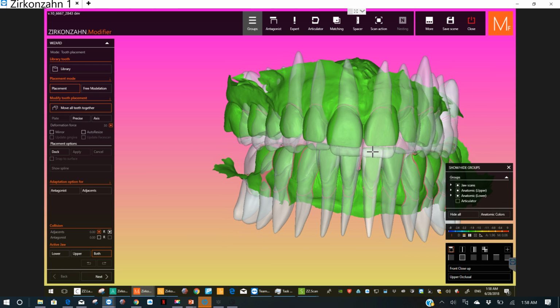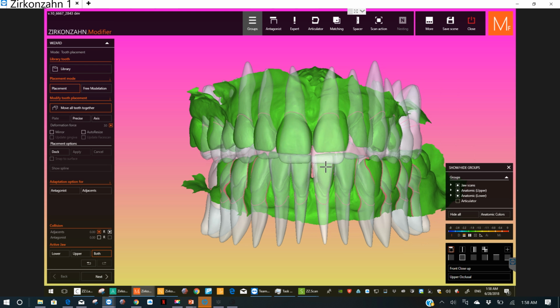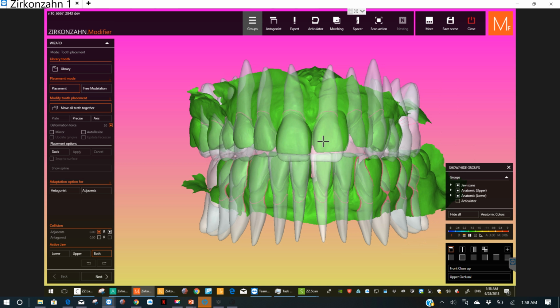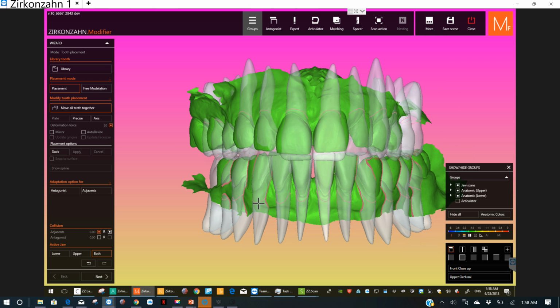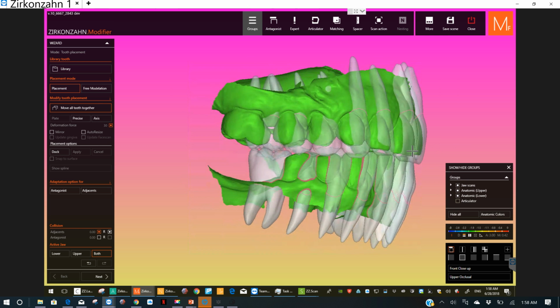If you want to err on a little bit of the long side, it's easy for us to adjust it. It's hard to add. So I kind of automatically just, if you did a good job lining it up, you should trust what you did, and it'll do a pretty darn good job. That might be a little bulky in the front. So now I'm done with the basic placement.